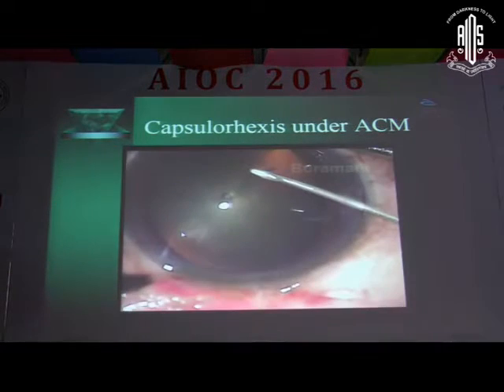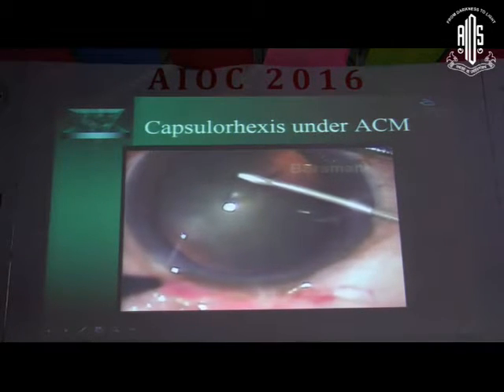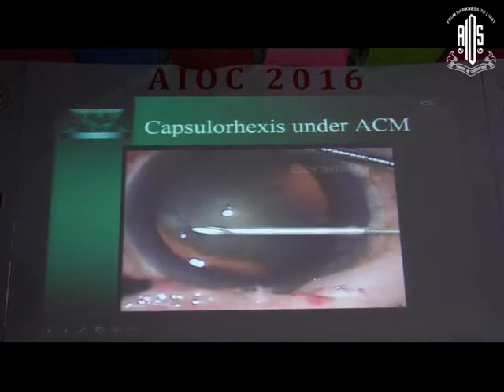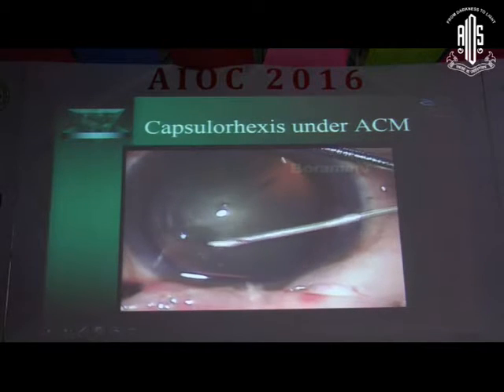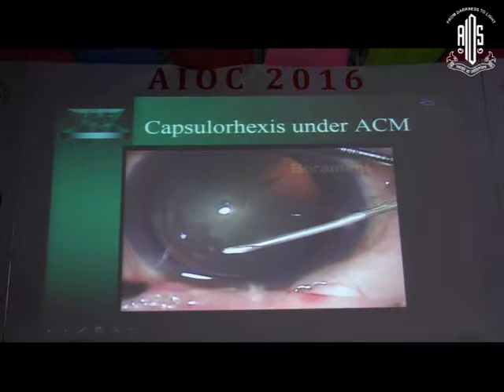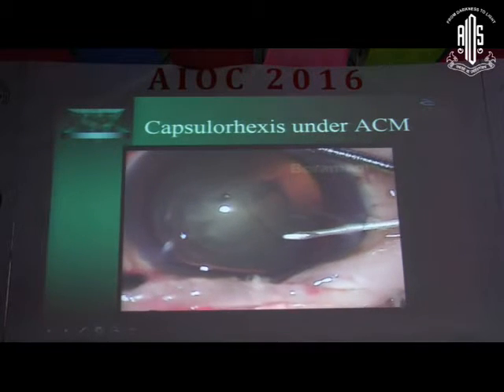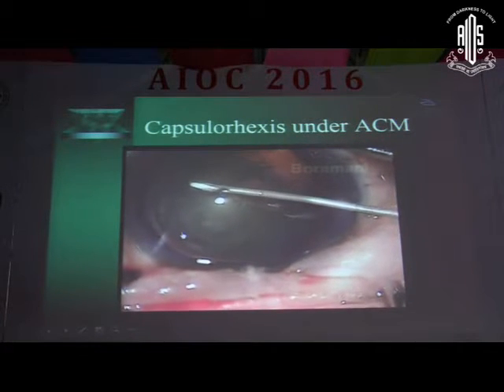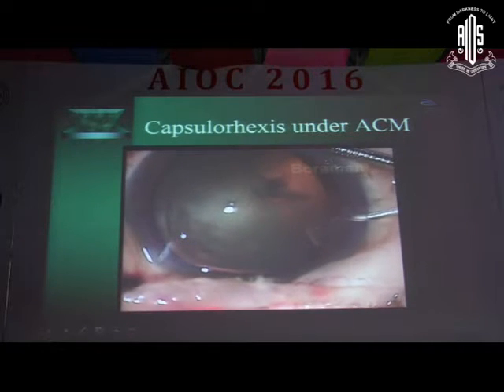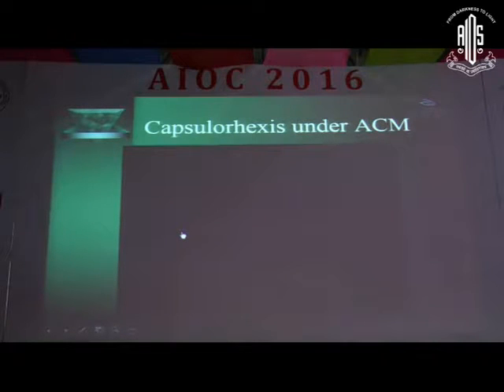As Dr. Parikshit has mentioned, ACM also helps in capsulorhexis. Without viscoelastic, you can do capsulorhexis because there is continuous fluid pressure and you are working in a deep chamber. So there is no need of repeatedly instilling viscoelastics, and only with the bent needle you can do the capsulorhexis by passing the needle through the side port. Generally in this technique, my side port is not complete when the capsulorhexis is done. Only after the capsulorhexis, I again insert the MVR needle in the side port and make it a regular side port, so that the capsulorhexis also is a totally closed chamber technique.